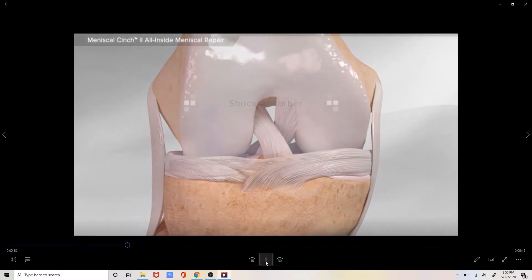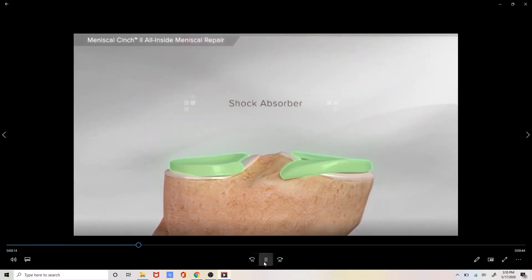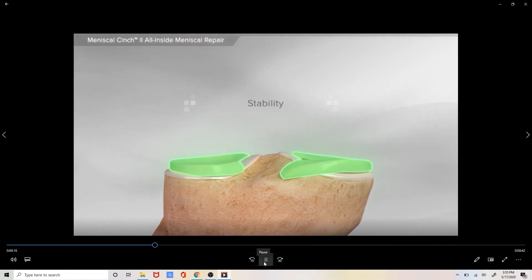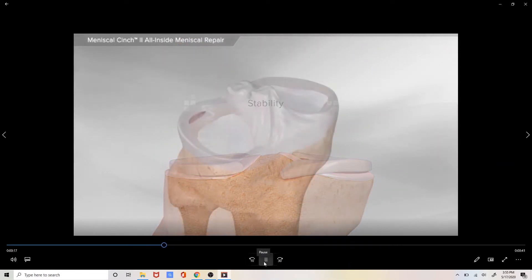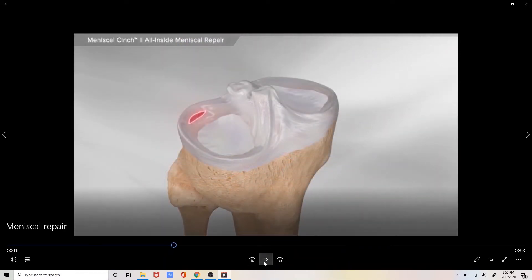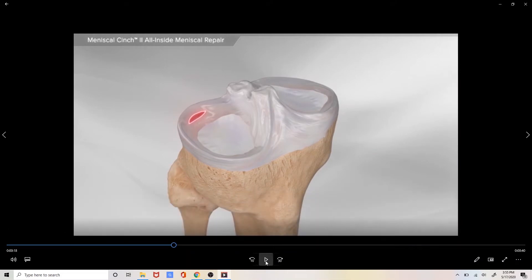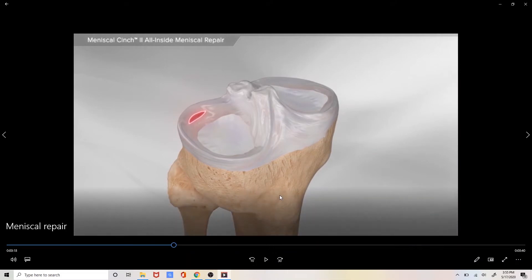The meniscus acts as both a shock absorber as well as providing stability to the knee. If we look carefully at this knee now you can see the two different menisci in the knee. This is the outside part of the leg. This is the inside part of the leg.